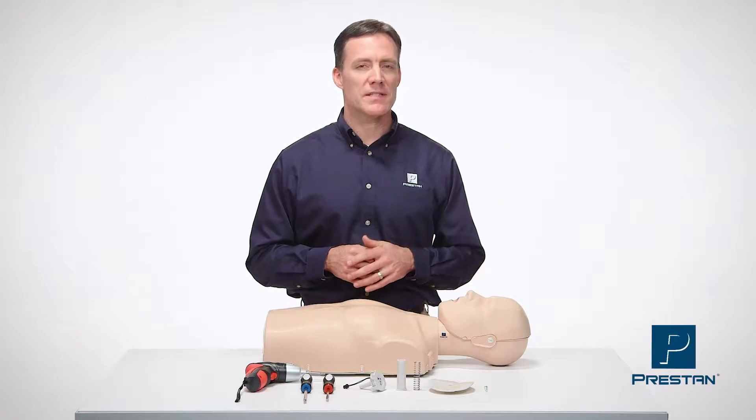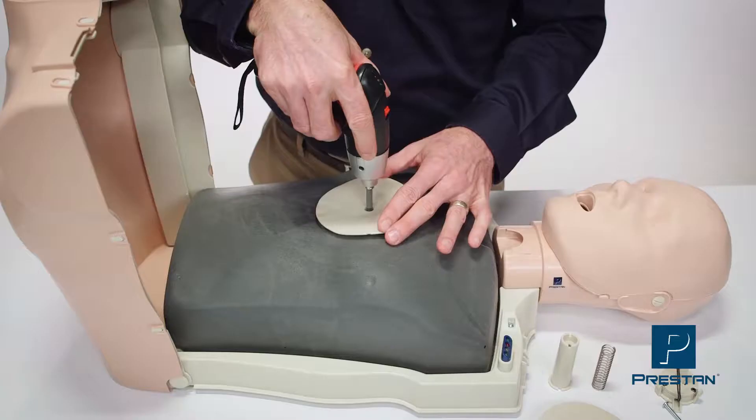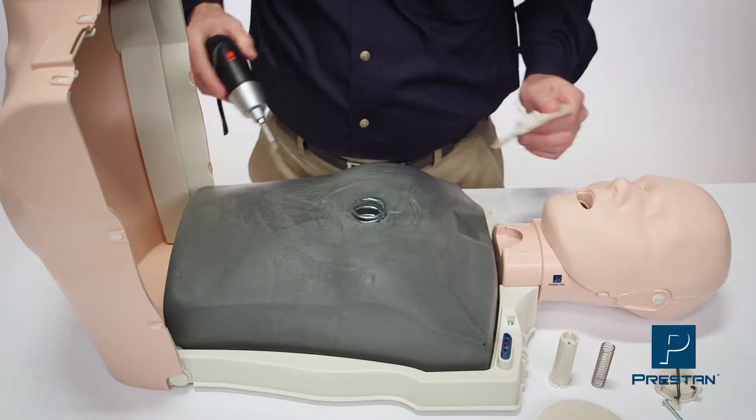Today we will show you how to replace the compression assembly. We're going to start by removing the old chest plate.